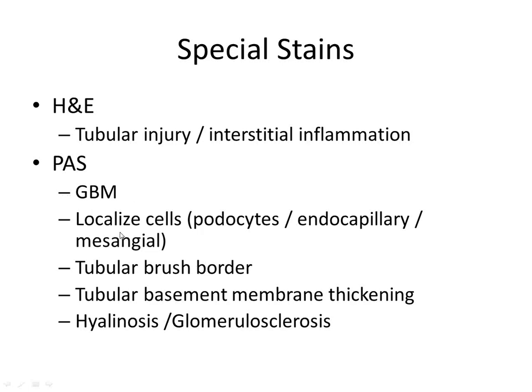And I did send out copies of the publication that we had in JVM Supplement that has some of these discussion points as well. But it's going to help you evaluate the glomerular basement membrane and look for thickness of the glomerular basement membrane. It's also going to really help you localize where those cells are in the glomerulus.